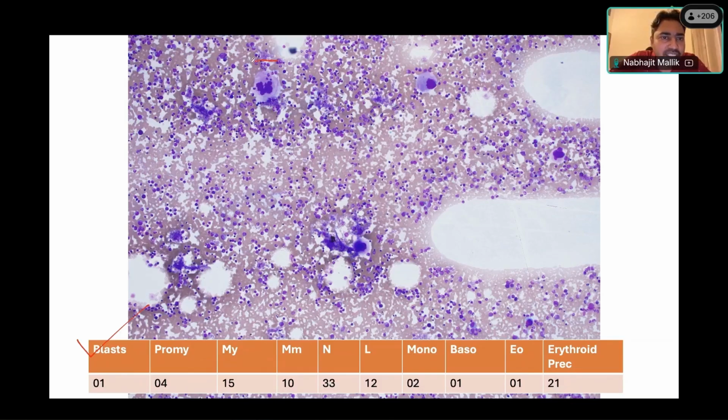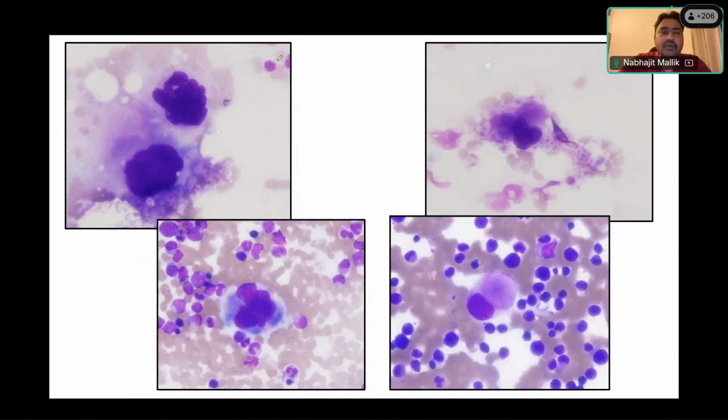What kind of a megakaryocyte is this one? The one that I'm drawing right now, Ekta? So hyperlobated. Right, hyperlobated. Absolutely. So we have some hyperlobation also that we note here. Okay, so in the next slide, I've given you some collage of these megakaryocytes. So can you comment on this, Dr. Ekta? What type of megakaryocytes are here, and what will you say about these megakaryocytes?